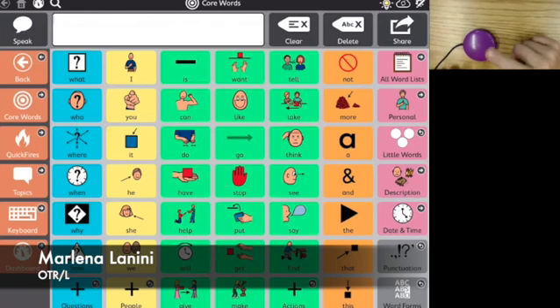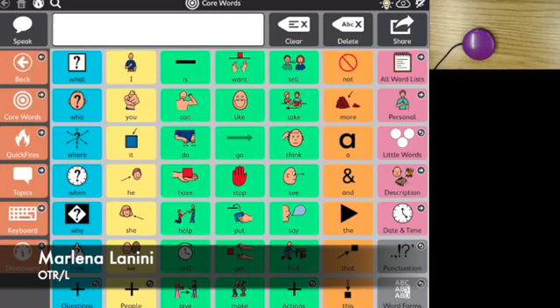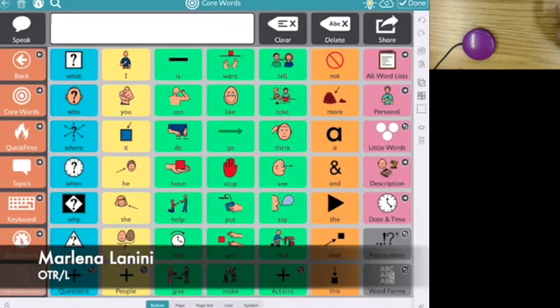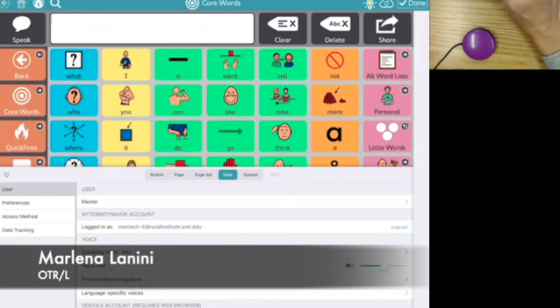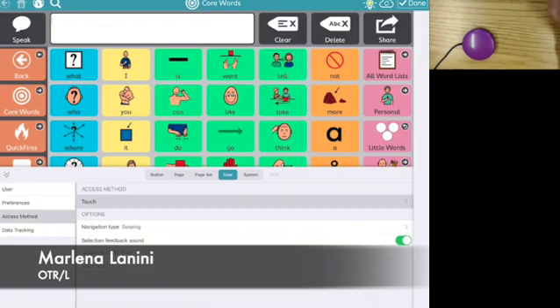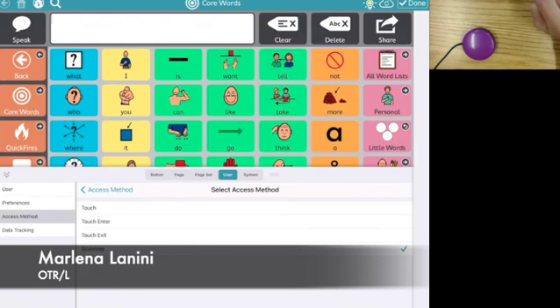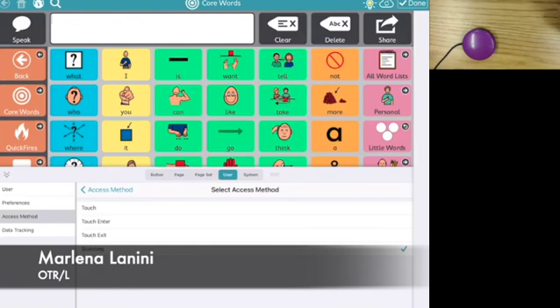The first thing that we need to do is connect this switch to my communication device, which I've already done. Then I need to go into the settings of my communication app and change it so that it has an access method for switching. Default is always set to touch, and I'm going to change it to scanning so I can use some switches.